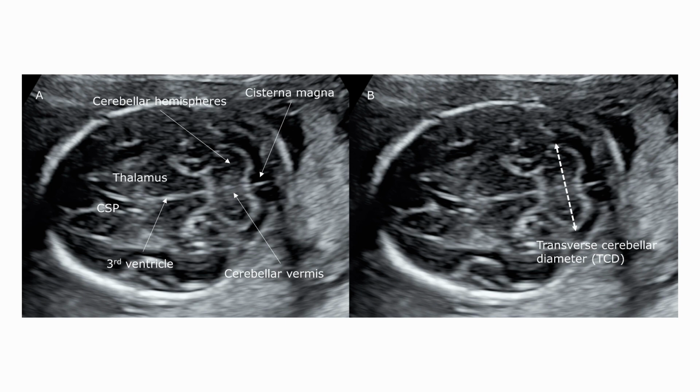So let's just stop right here for a second and think about when we're doing a transverse image of the fetal head, it may be a different position of the ultrasound probe because the baby's head may be on the side or up at the top or down below or kind of angled in a diagonal way.